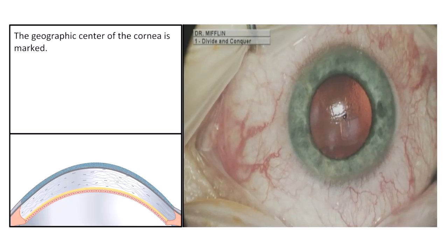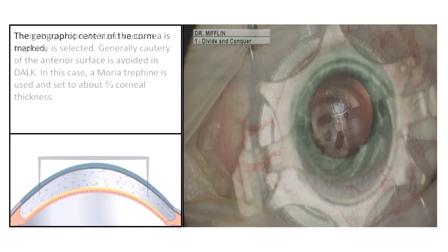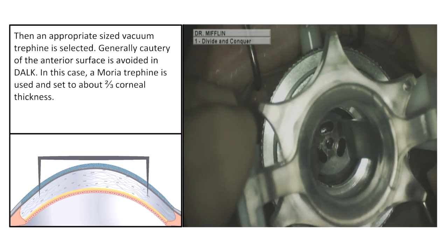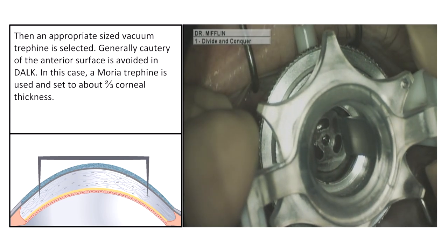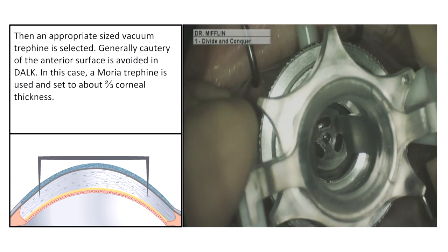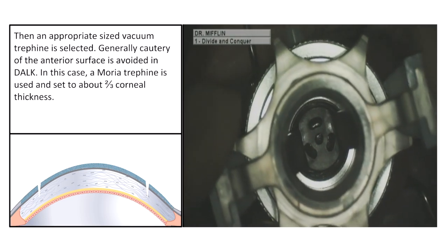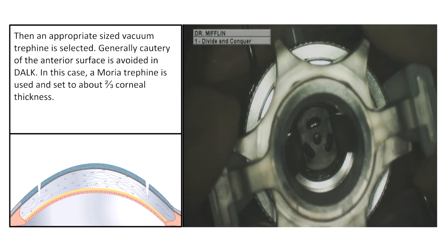The geographic center of the cornea is marked, then an appropriate sized vacuum trephine is selected. Generally, cautery of the anterior surface is avoided in DALK procedures. In this case, a Moria trephine is used and set to about two-thirds of the corneal thickness.